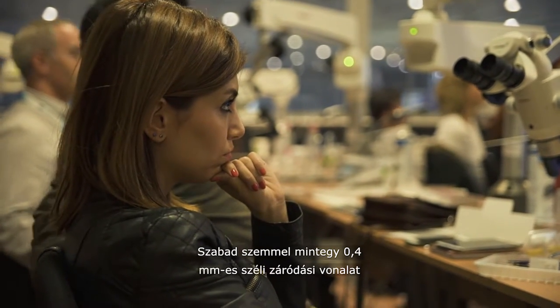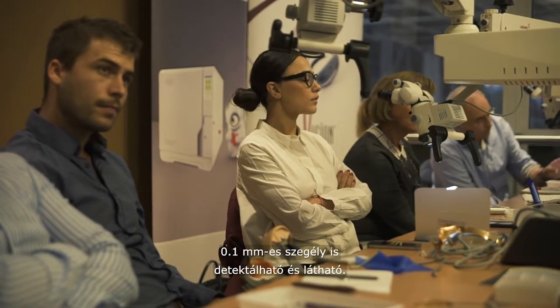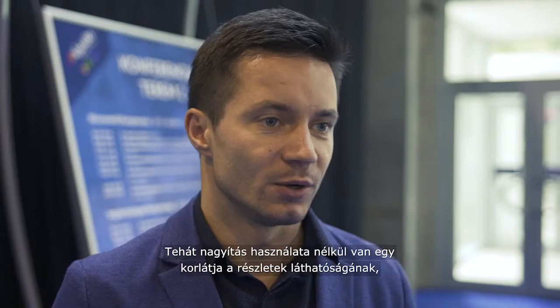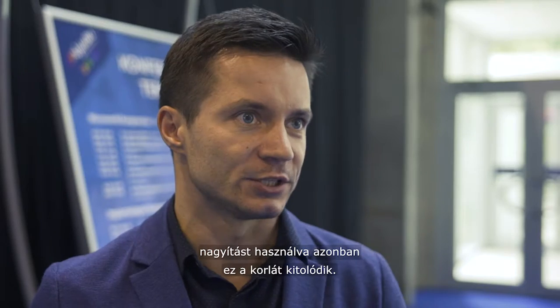With the naked eye, you can see the margin at 0.4 mm — you cannot see closer. With the microscope you can do it at 0.1 mm. So there is a clear limit of vision control when you're not using magnification versus when you are.